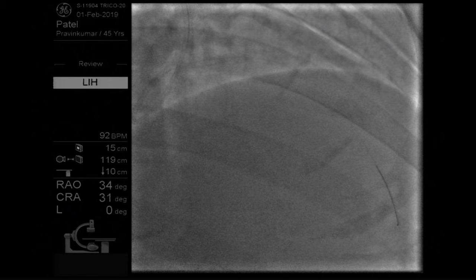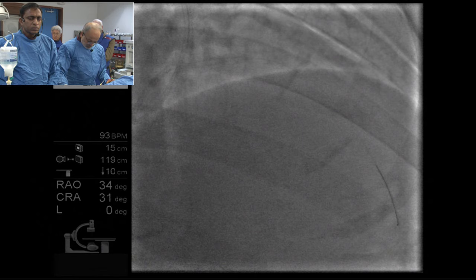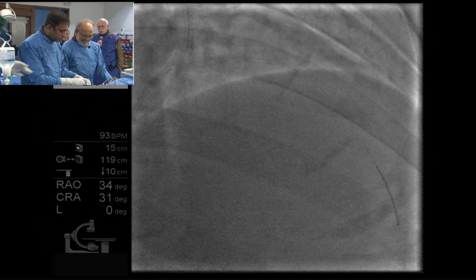I think if you have a lot of bulk, the balloon is not going to help you acutely push that out of the way. And so in an intimal hyperplasia type situation, it's probably not very effective because you have to fight the recoil anyway. Ian, what is your opinion about drug-eluting balloon? We don't use them. I have a hard time understanding how the drug is going to actually get to the vessel and stay there long enough to make a difference.